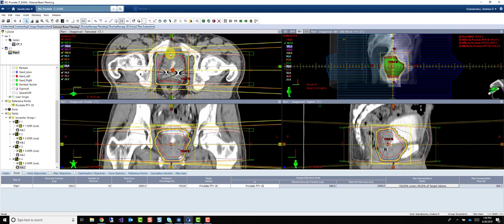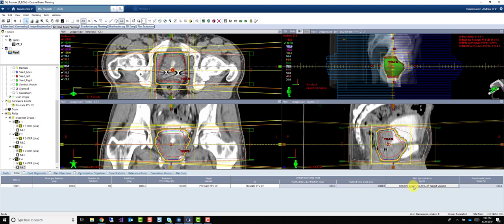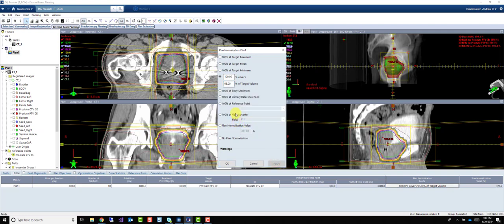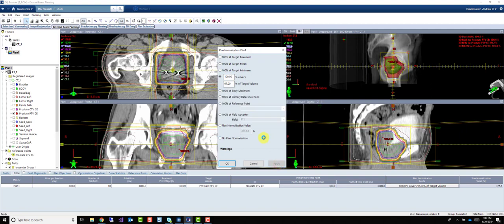You can see with that decreased margin, it's having a lot harder time covering that target. So we're not going to get such good coverage. So let's back off a little bit. We probably don't need 99.5% on our PTV.